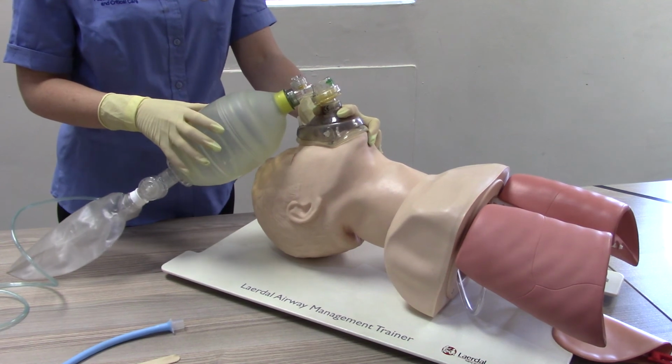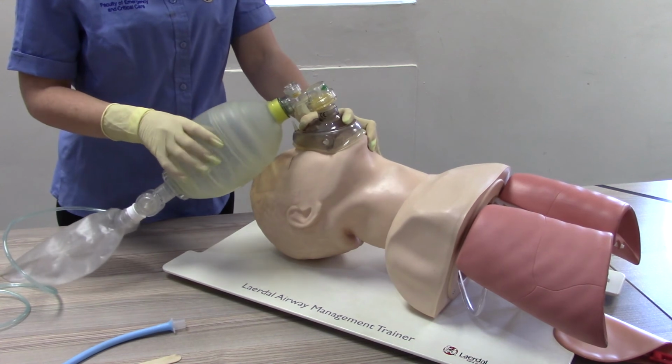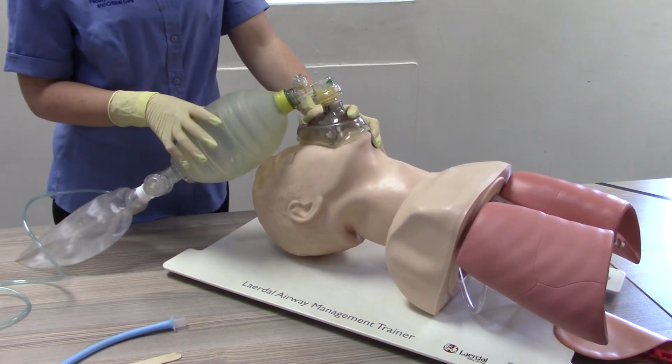Ensure correct rate of ventilation, 1 ventilation every 5 to 6 seconds for adults, 1 ventilation every 3 to 5 seconds for infants and children.